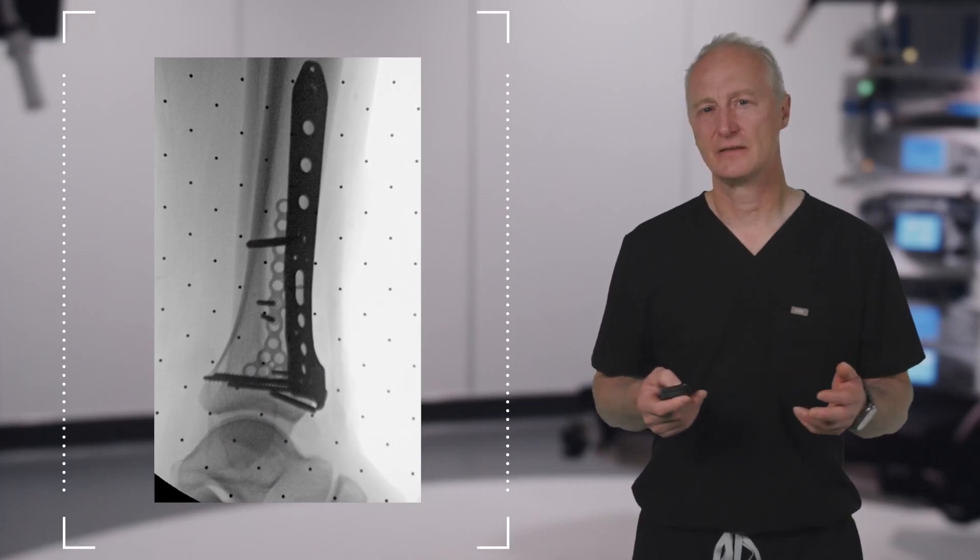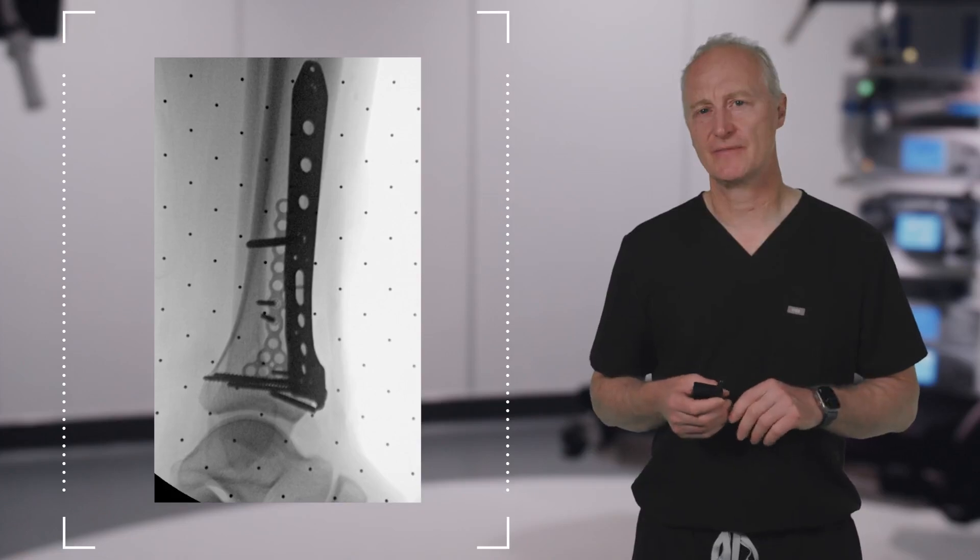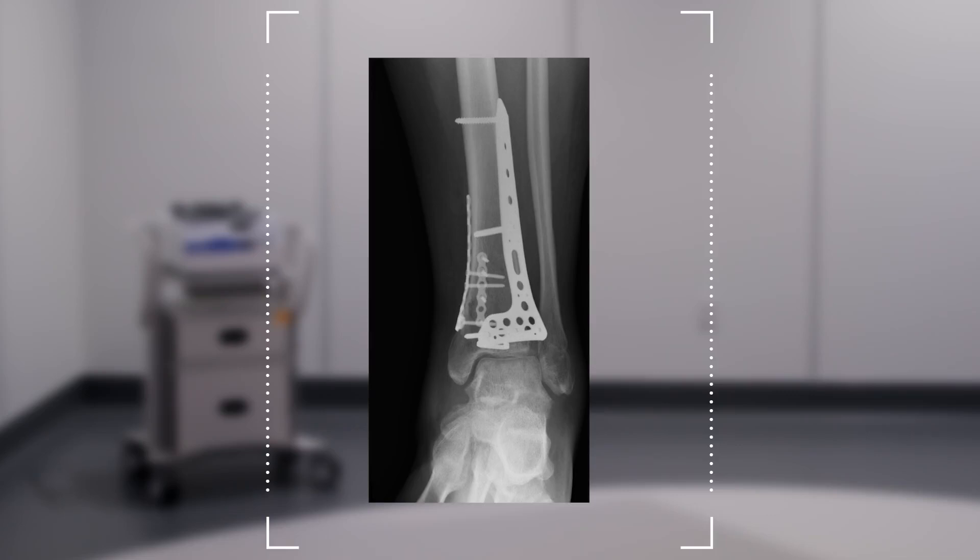To that end, we look at the lateral. It's very important that the talus remains centered under the reduced distal tibia. The Crew Lock Locking Compression Screws really help achieve this in providing further compression of the reduced articular surface, sealing that joint space, preventing the intrusion of articular fluid between the fracture fragments as they heal.